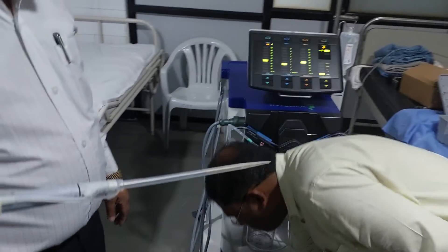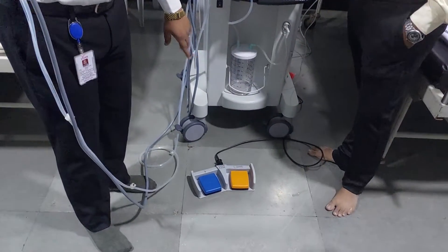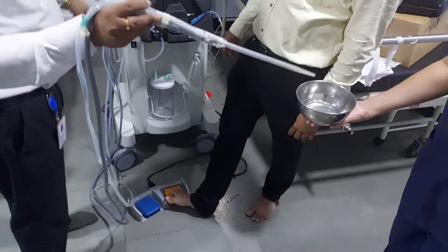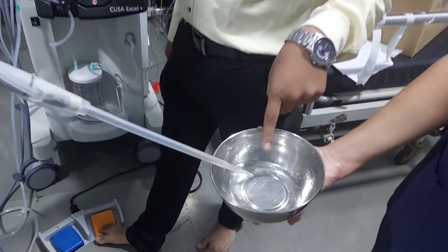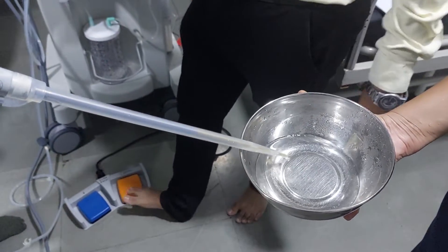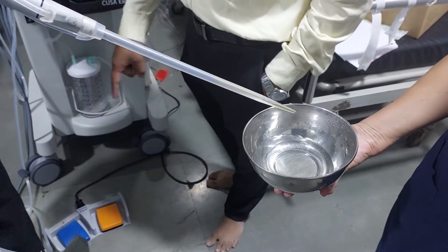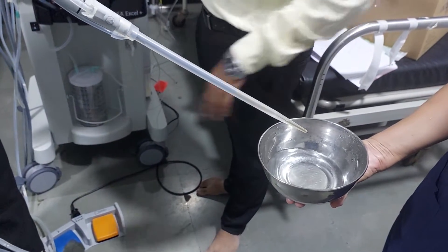They have provided a foot switch with color coding: one is orange color and another is blue color. When you press the orange pedal, all three functions are operated simultaneously. When you press the blue color, only irrigation — water will flow. So the blue foot pedal is only for the irrigation purpose, and for the main function we have to use the orange pedal.